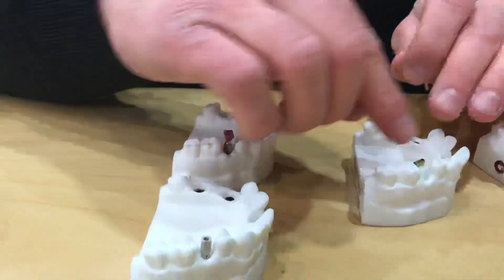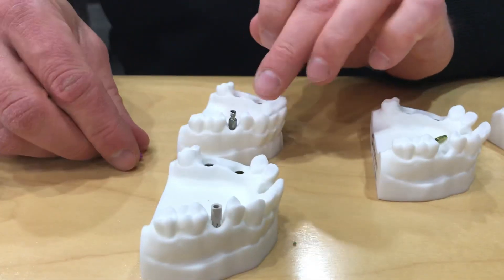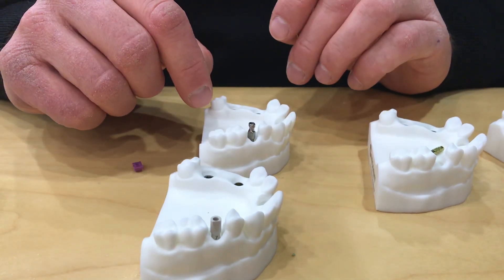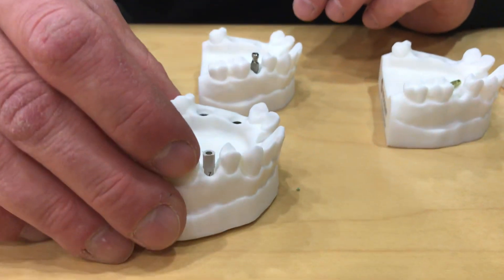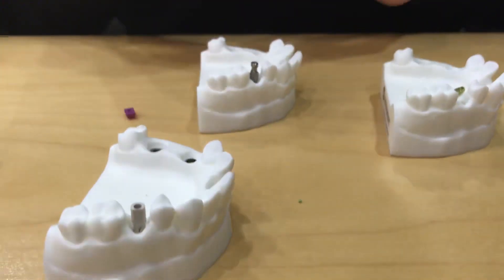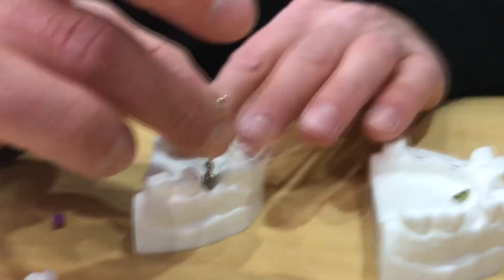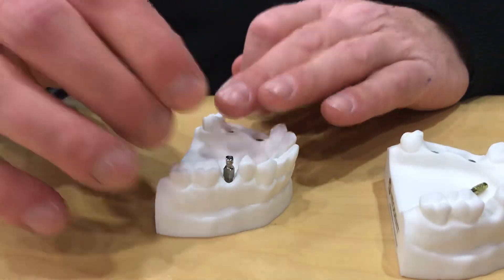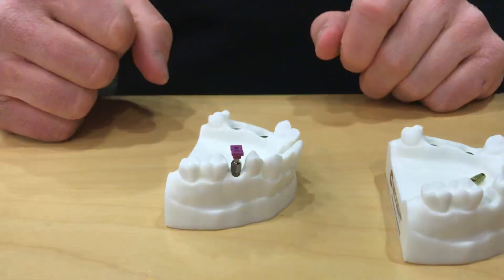Moving on to the next step: we remove that tissue measurement gauge and place a closed or open impression coping at the implant level. An option digitally is our scan body or scan flag. Back to a conventional method — we make sure that our closed tray is down, make sure that our screwdriver is tight, and then we place our purple cap on top and it snaps into place.